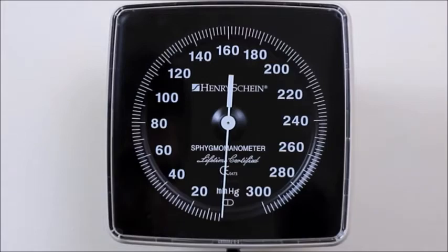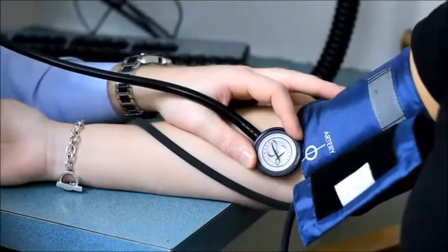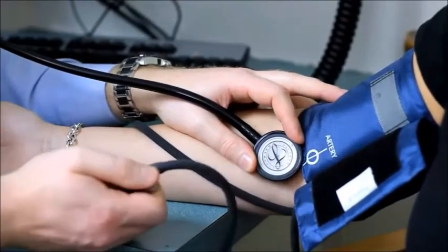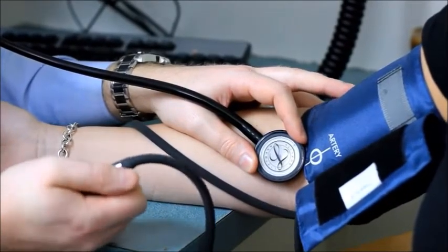To ensure that diastole has been reached, the cuff pressure should continue to be slowly deflated for an additional 10 millimeters of mercury beyond the fifth Korotkoff sound.